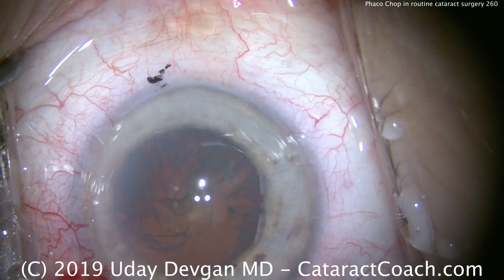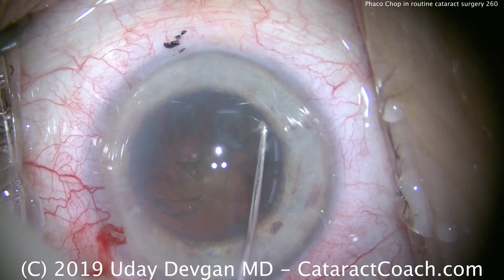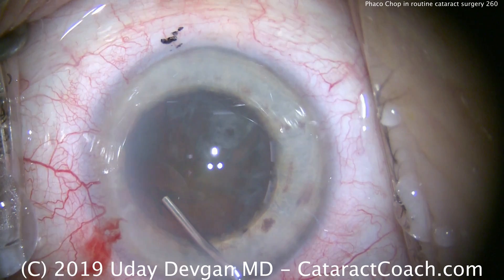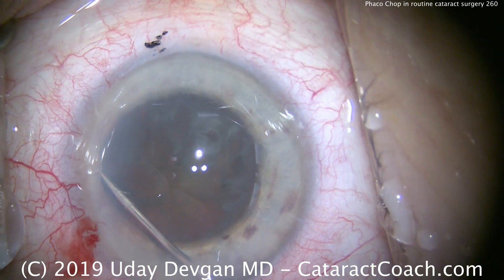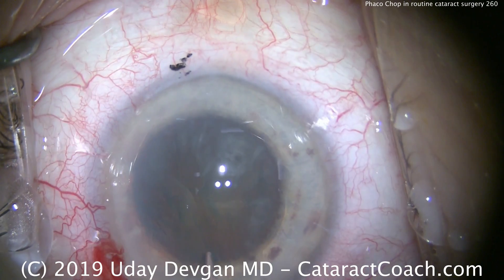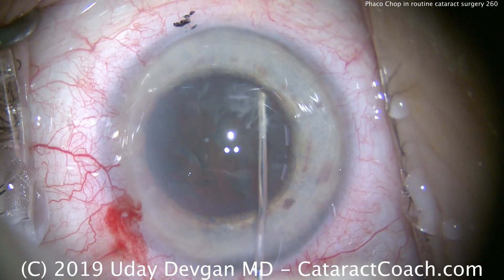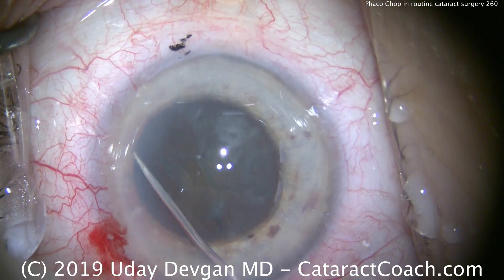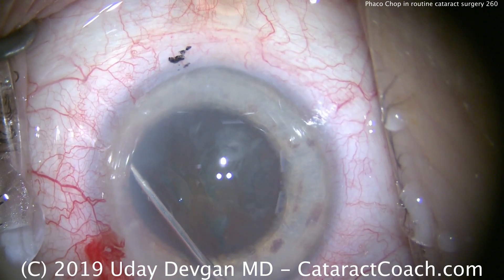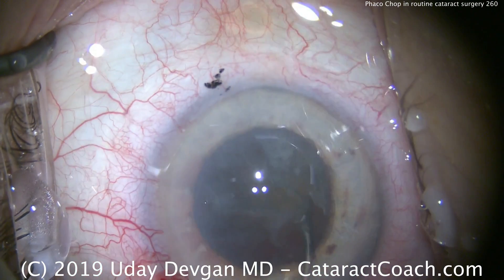We'll go back to the normal lighting setting and do a little hydrodissection. With a shallow anterior chamber, I do not want to prolapse the nucleus out of the bag. We're going to leave it in the bag — just enough hydrodissection so I can rotate the nucleus. Let's try to rotate it. Maybe a little more hydrodissection here and there. We'll try to rotate one more time — that looks pretty good, it's rotating.